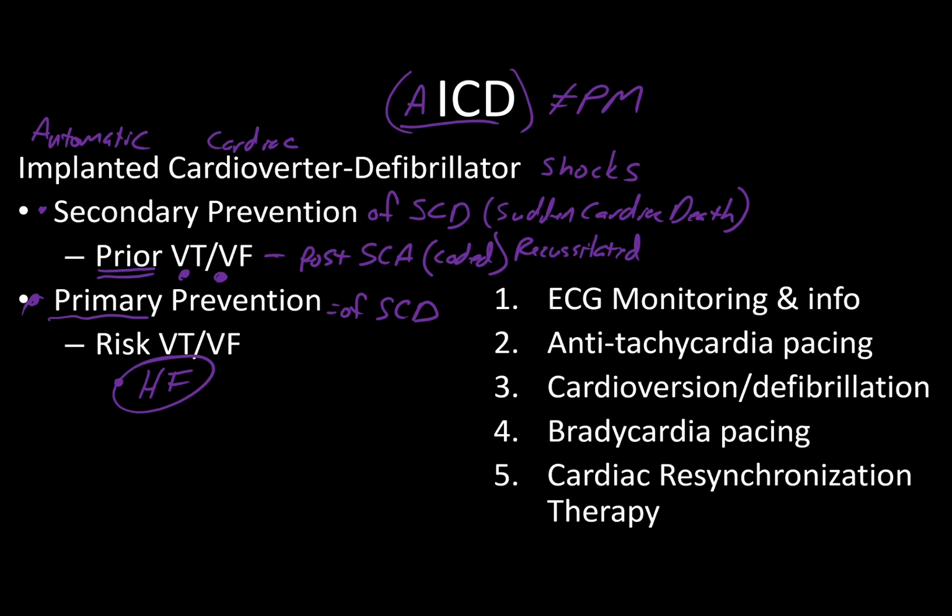The most important thing I want to share, and I giggle when I say this because I've had it happen: it hurts. The patients can feel it. In fact, I've had a case where a patient kept going into VTAC because they weren't taking their meds like they should. And so it fired a handful of times in a single day. It's like grabbing a hot fence.